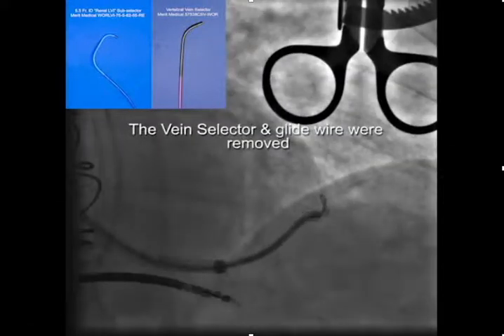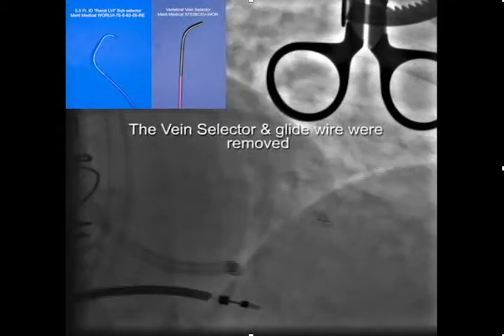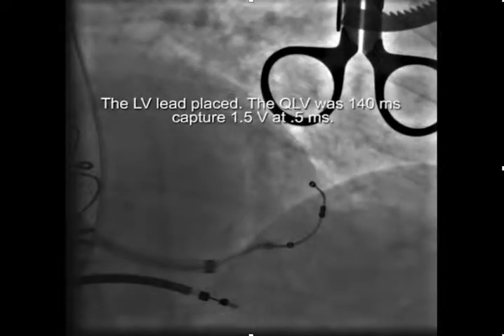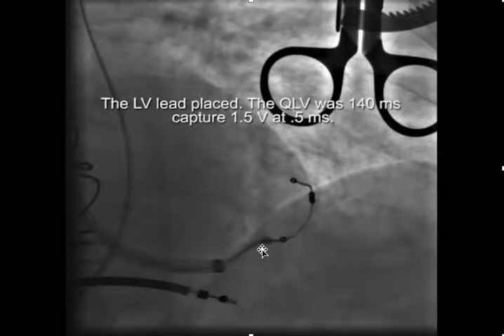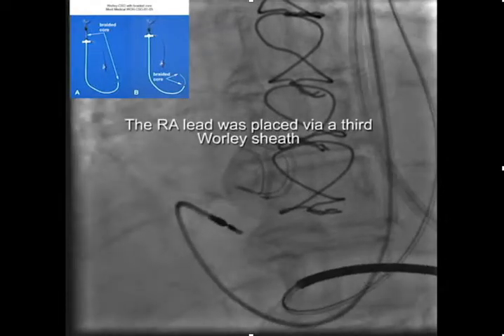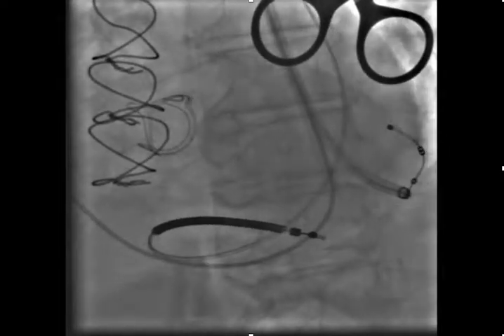We slid the subselector deep into the target vein, then removed the vein selector and glide wire and inserted the LV lead. With the LV lead safely in place, we left the guiding catheter and whirly sheath in place while we went on to implant the atrial lead — advancing the right atrial lead into the atrium and screwing it in place.